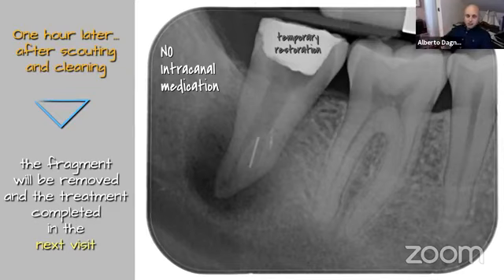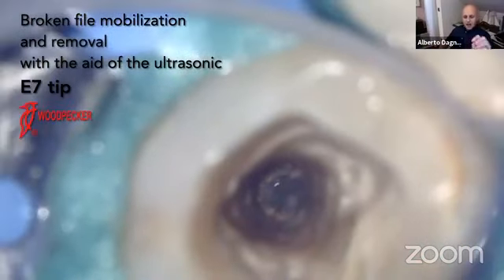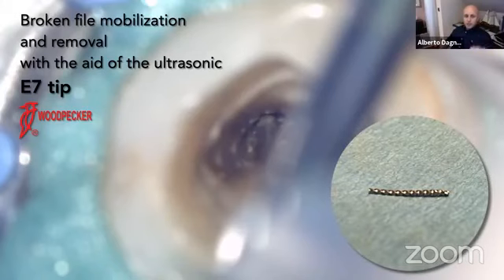So in the second visit, I restarted the treatment, putting my attention to the removal of this instrument, and with a long ultrasonic tip with a small apical diameter, I vibrated the head of the file and mobilized the file, since the file moved away, with no necessity of specific kits for instrument removal, because the fragment was blocked into a straight portion of the canal, and I was able to move it, to mobilize it, and to remove it coronally.